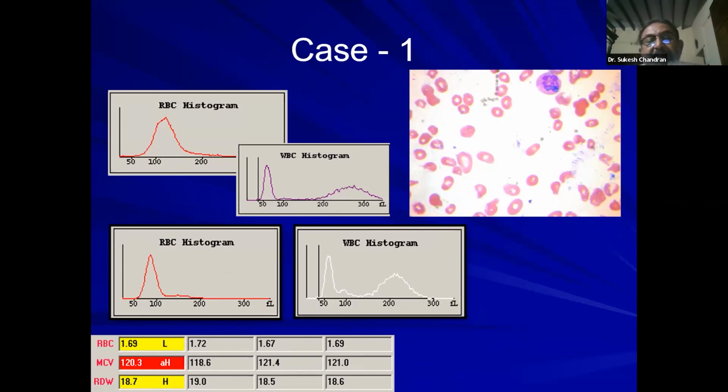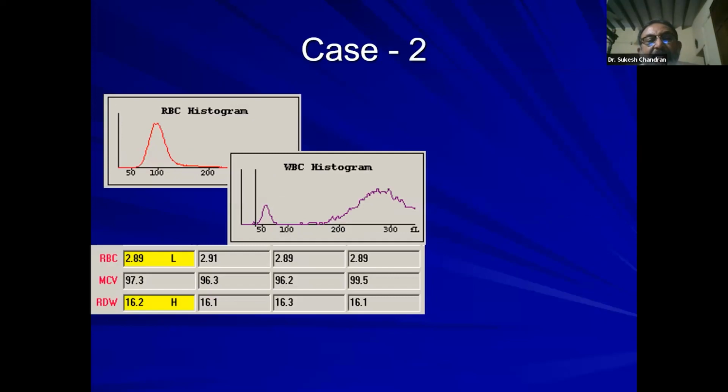They are nothing but neutrophils which have more than 5 segments. They are the hypersegmented neutrophils. But more than that, look at the valley between the lymphocyte and the neutrophils. When you get a valley like that, it is always hypersegmented neutrophils. But the problem with megaloblastic anemia is that sometimes you can have a dimorphic anemia. You can see that there is a dimorphic anemia here, but you can hardly see the two populations in the RBC histogram, where there is only a slight division between the large cells and the small cells.